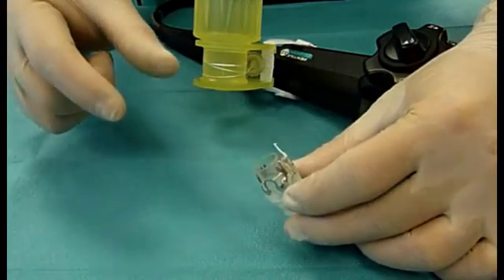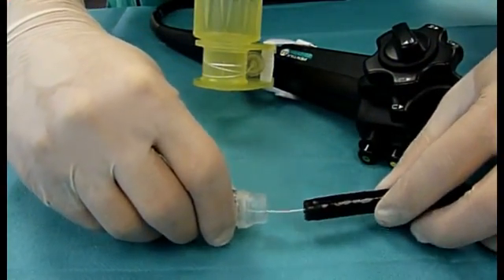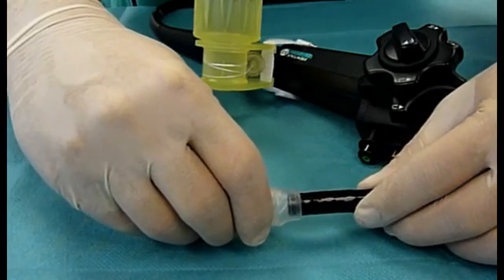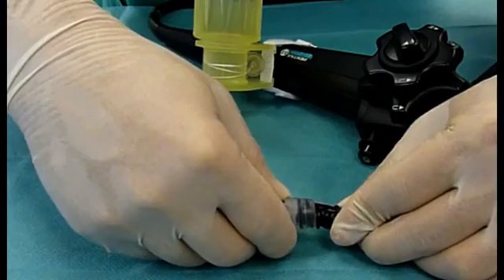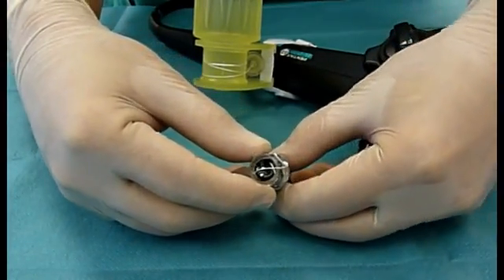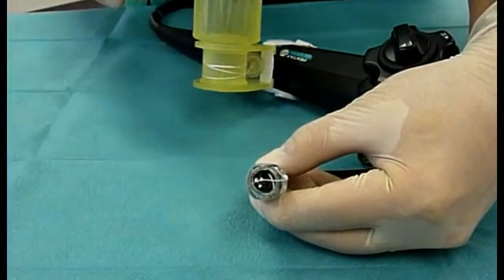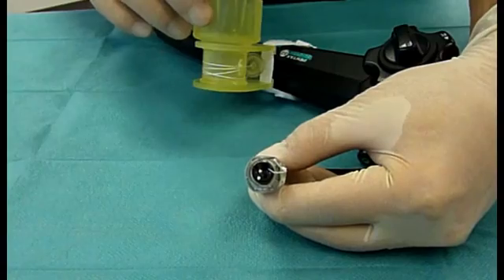The OTSC applicator cap is positioned so that the end of the thread is directly adjacent to the working channel and the thread runs right through the working channel of the endoscope. The thread is further wound up with the handwheel until mild tension is felt.